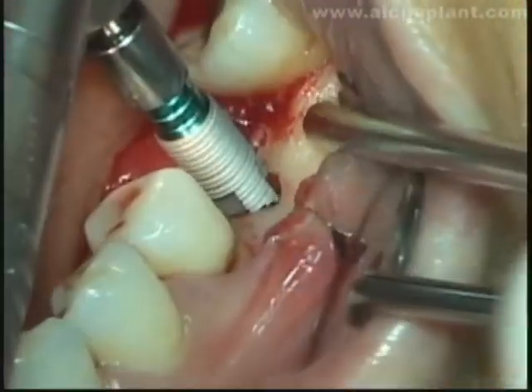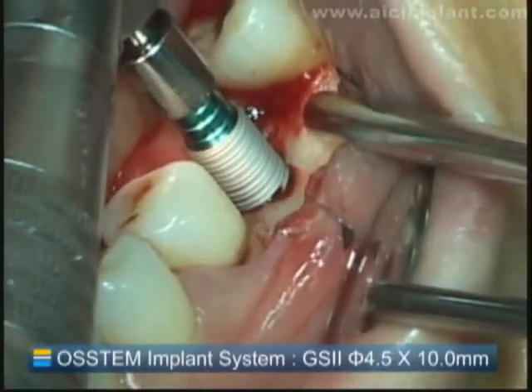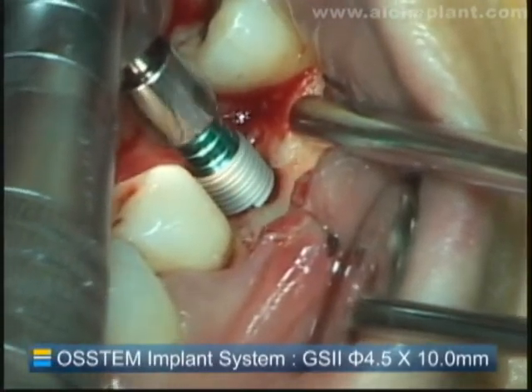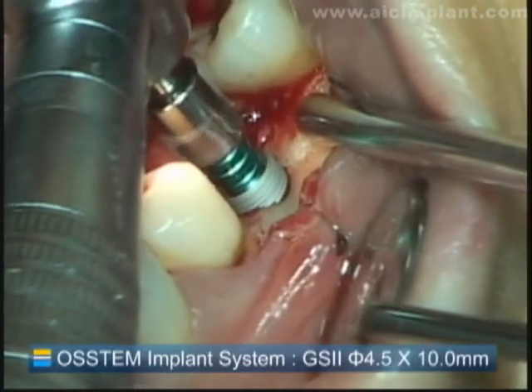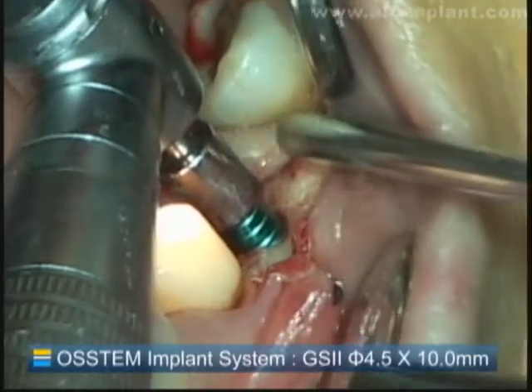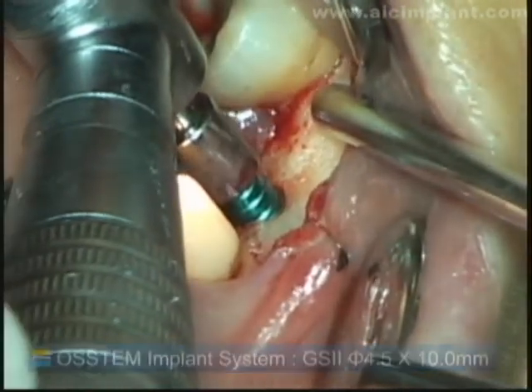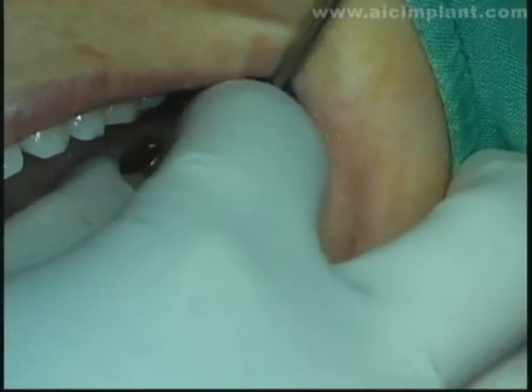A GS2 implant with diameter of 4.5 millimeters and 10 millimeter fixture will be installed. This installation depth is just right. Installing the GS fixture about 0.5 millimeters subcrestally is recommended.